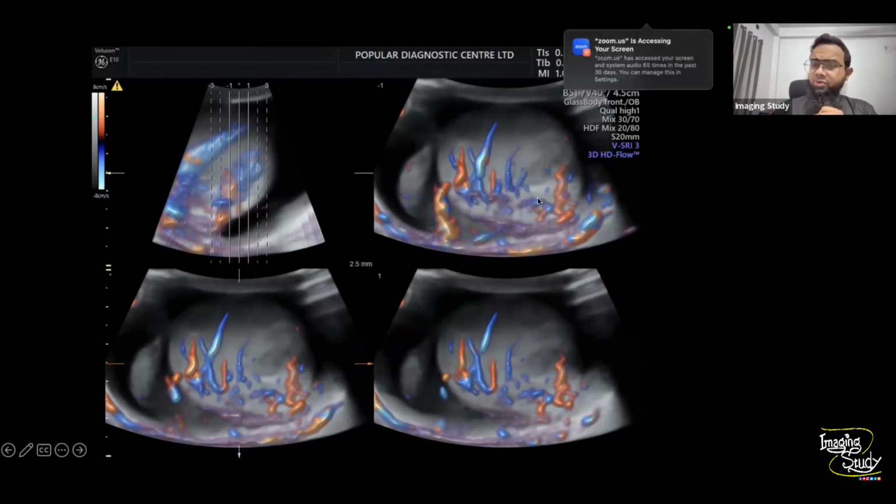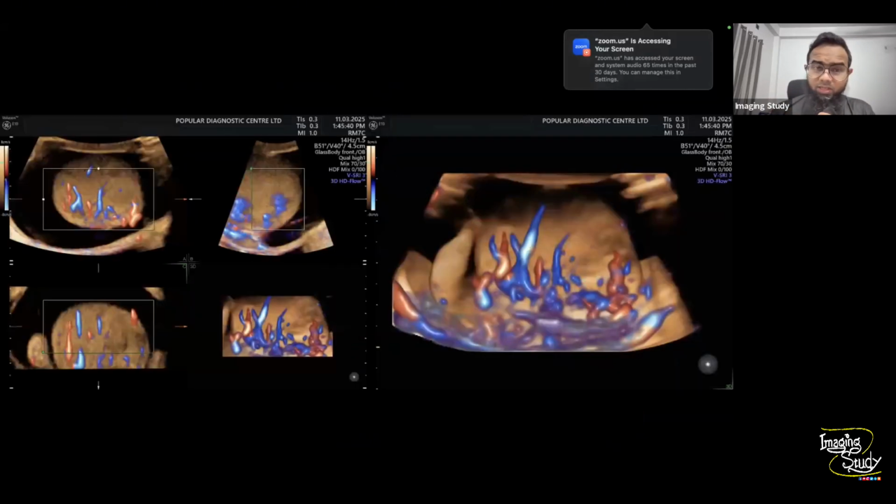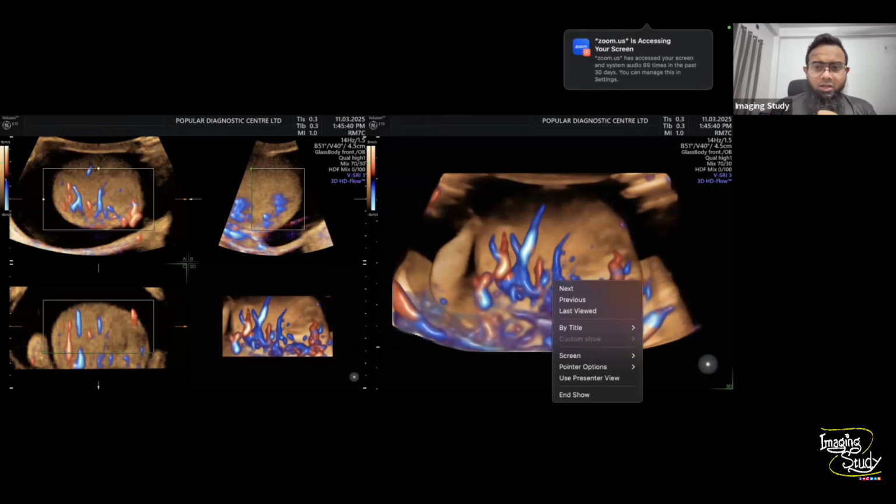You know, we have taken it with our regular curvilinear volumetric probe. So the resolution may not be as good as you have seen on the linear probe setting, but still it's very good to understand high vascularity within the testis. So we have just adjusted and rendered the image like this. So in near future, all these cases will be shown in 3D like this, hopefully.